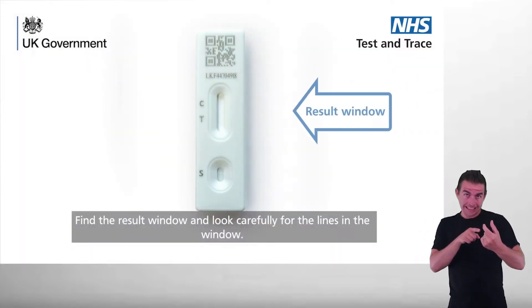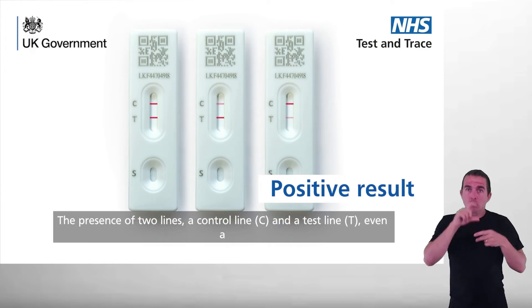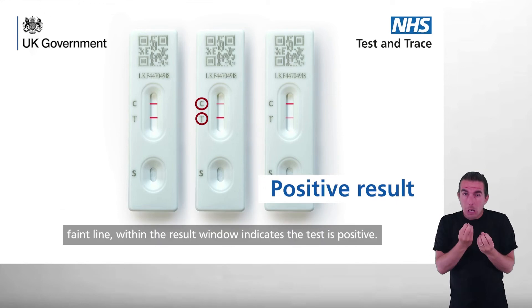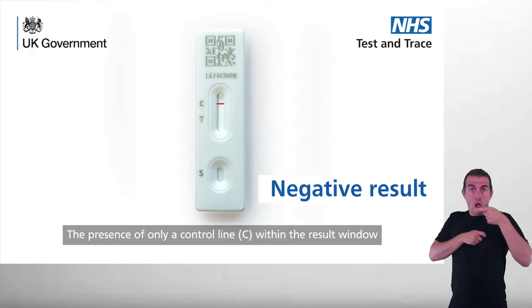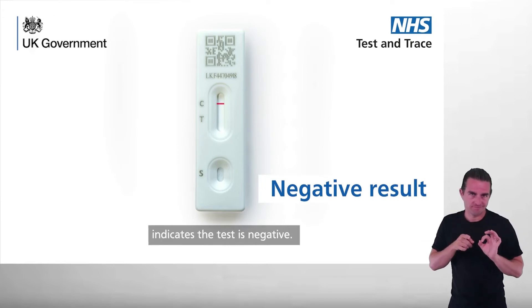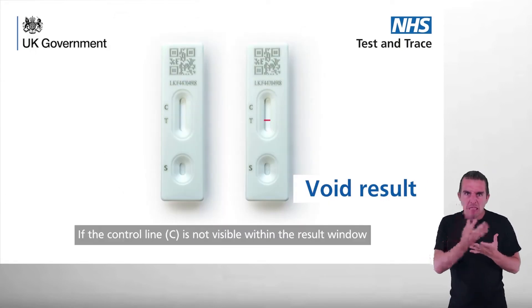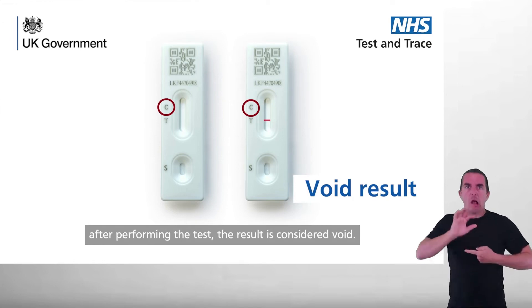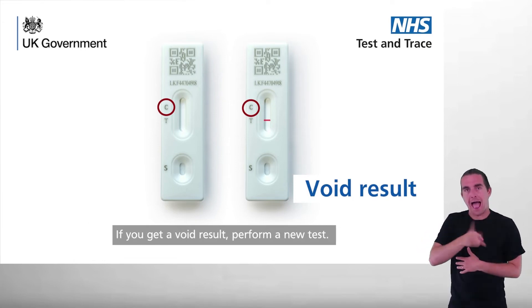Find the result window and look carefully for the lines in the window. The presence of two lines — a control line C and a test line T, even a faint line — within the result window indicates the test is positive. The presence of only a control line C within the result window indicates the test is negative. If the control line C is not visible within the result window after performing the test, the result is considered void. If you get a void result, perform a new test.